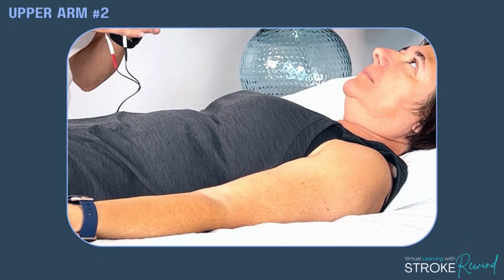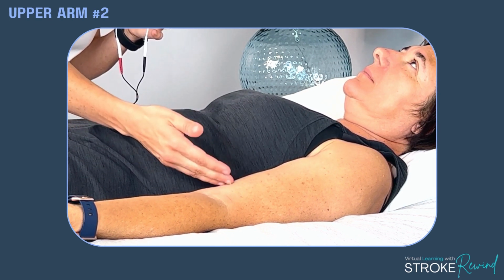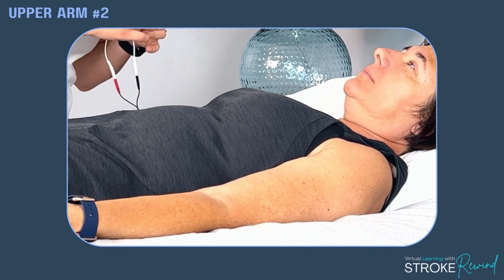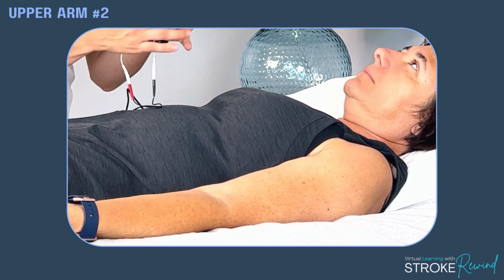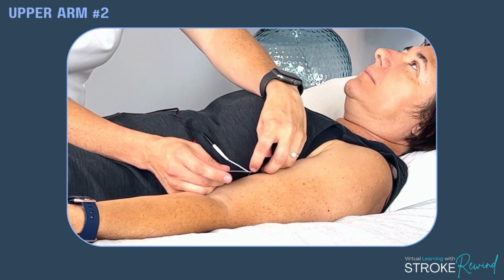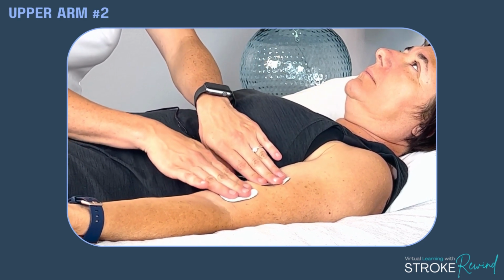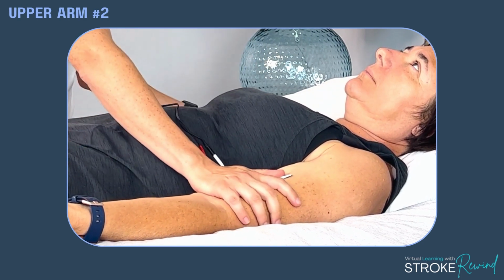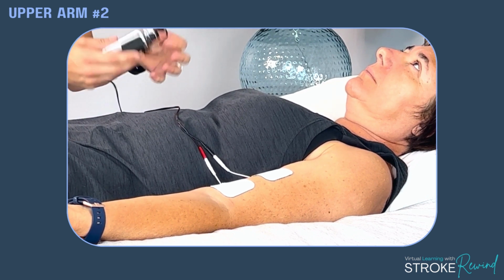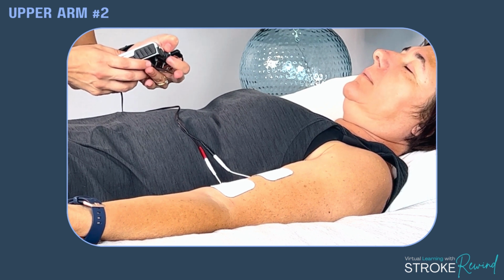So for the bicep or the front of the arm, you can do this on your side or laying down, but I'm showing you for demonstration purposes on her back because it's easier to see. But again, you're going to take these electrodes. I like to do black over red. You're going to find a meaty part of the bicep or the front of this upper arm, and you're going to take her through the same exercise. You're going to say, okay, I'm about to turn on the machine. Let me know when you can feel it.